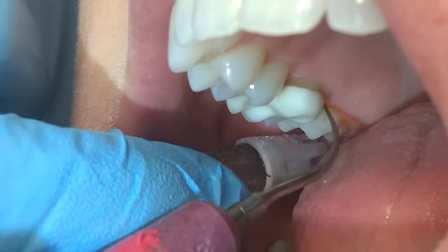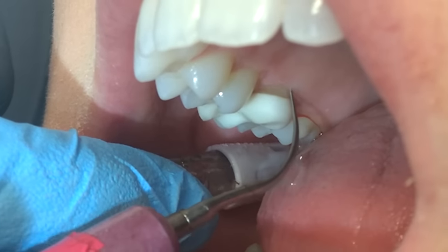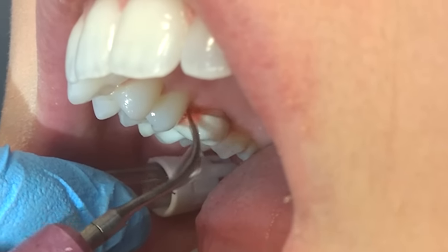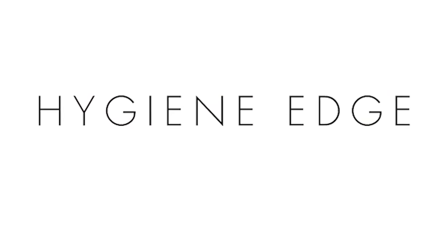Crown margins make a perfect hiding place for bacteria, so it is very important that we are caring for these areas to prevent disease. There is a special polishing paste available to you if you need to polish crowns, as it is not recommended to polish crowns with our regular prophy paste.